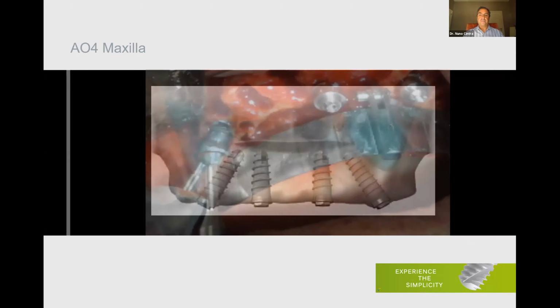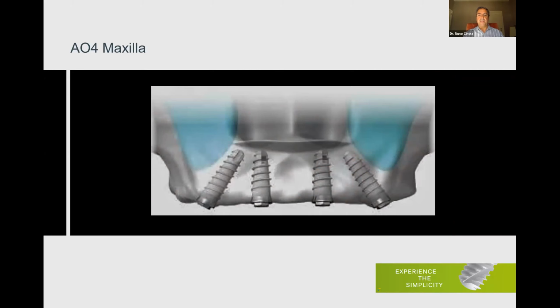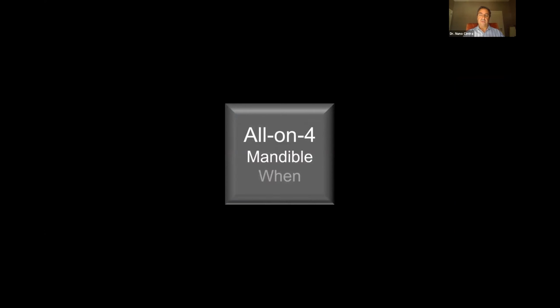So at the end of the day, what we want is this: 4 implants, 2 tilted ones at 45 degrees at the back, and 2 straight ones at the front, with a bicortical anchorage when possible. We'll come to that later on.